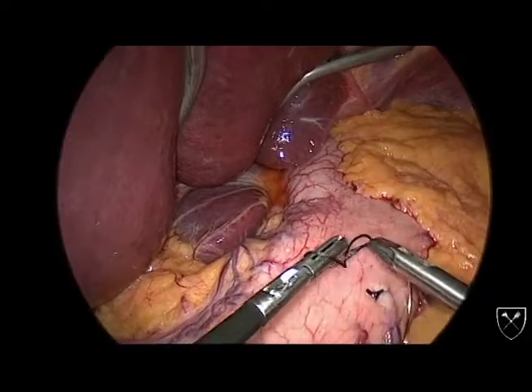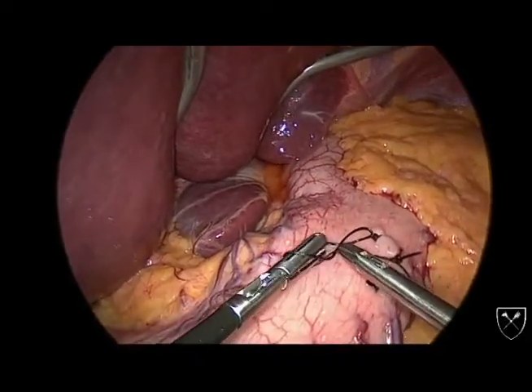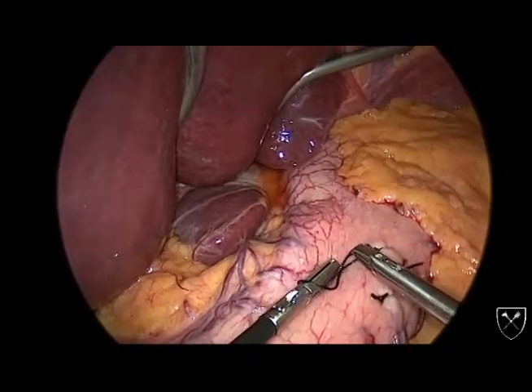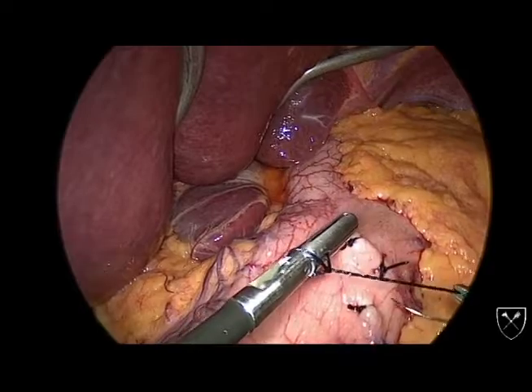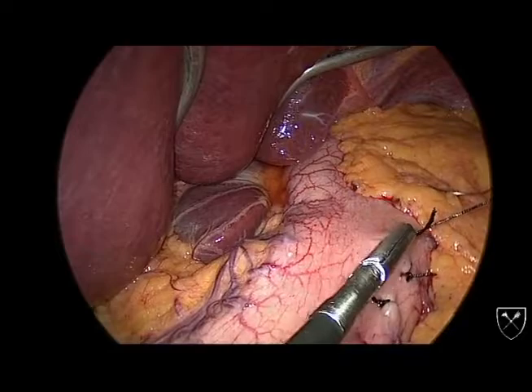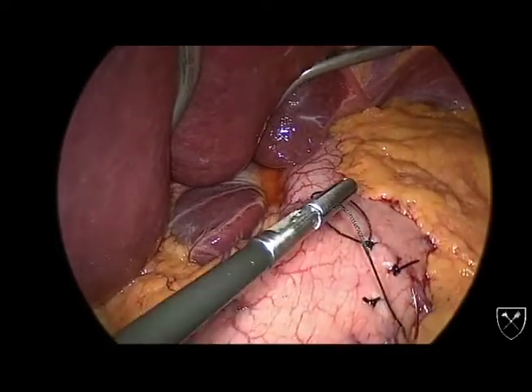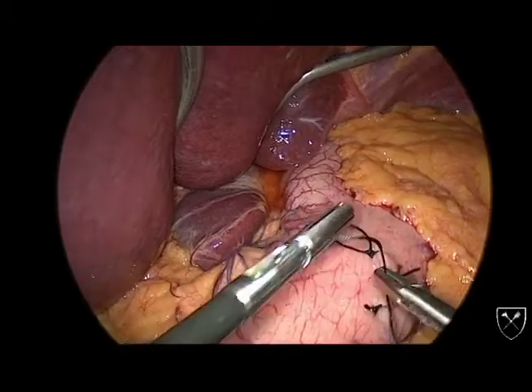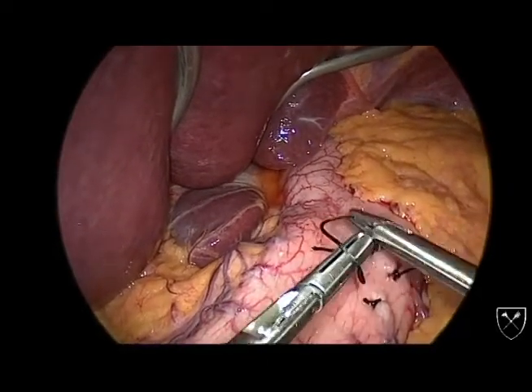A final reminder is to keep your instrument tips close to each other, tip to tip, so you have freedom to move and pick up the tail. If you get entangled, it is preferable to release the suture and start again. The last point is to work over the knot and not somewhere far away, especially if your sutures get shorter — keeping instrument tips close to each other gives you the most freedom.